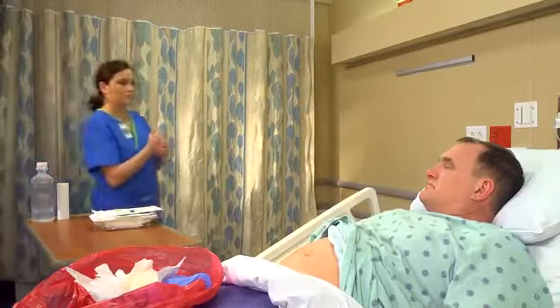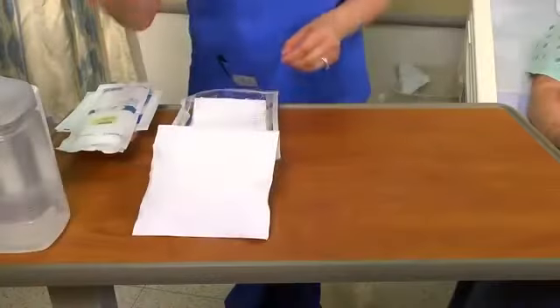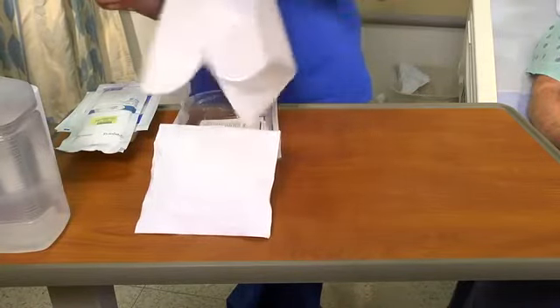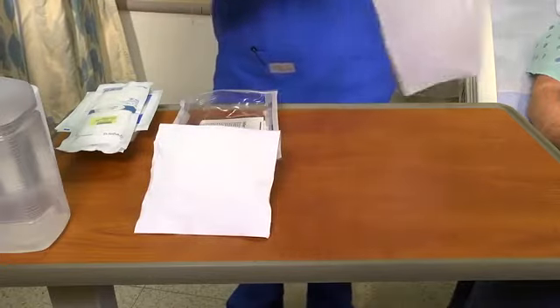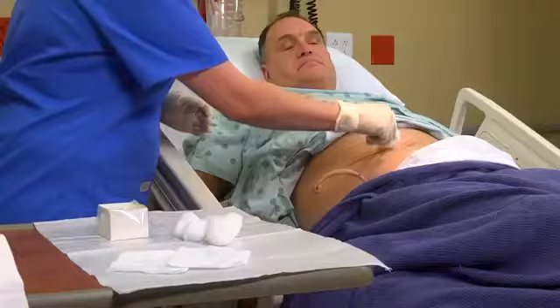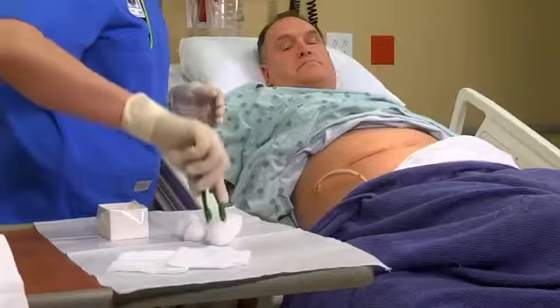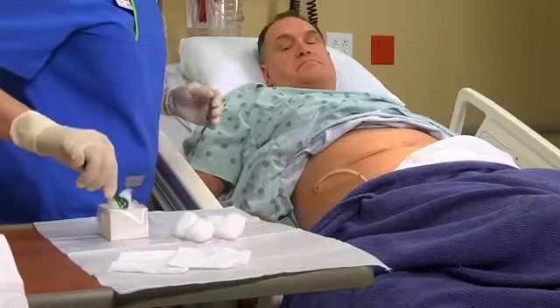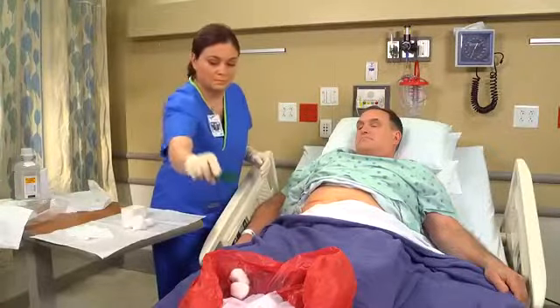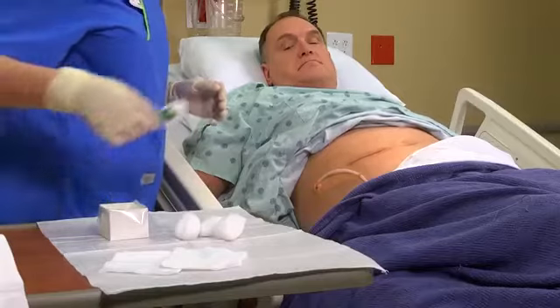Now create a sterile field by placing a sterile dressing tray or individually wrapped sterile supplies on the overbed table. If a sterile solution has been prescribed, pour it into the sterile gauze. Depending on your agency's policy, you may put on sterile gloves to provide wound care, or you may use a no-touch technique, which calls for wearing clean gloves to hold sterile forceps. If you use antiseptic swabs to cleanse the wound, use a new swab with every stroke. Or simply spray the wound surface with antiseptic.